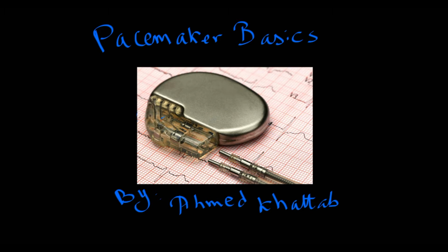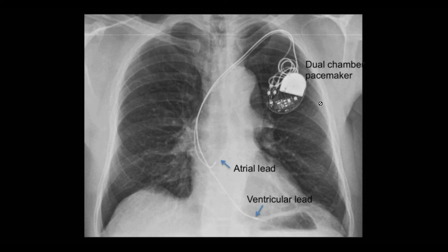So next we're going to have a look at the pacemaker. How does it look in a chest x-ray? So this is the chest x-ray, and as you can see, again, this is the generator or the can. This is the header, and here are 2 leads attached to it. So that makes it a dual chamber pacemaker. One of the leads, if you follow it, goes all the way to the atria. The second lead goes all the way to the ventricle. So atrial lead and ventricular lead.